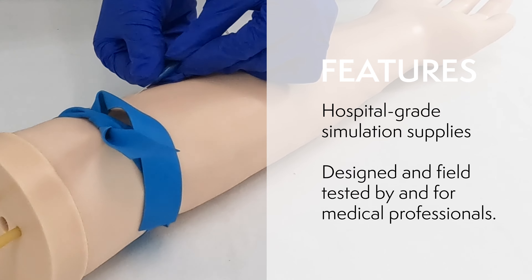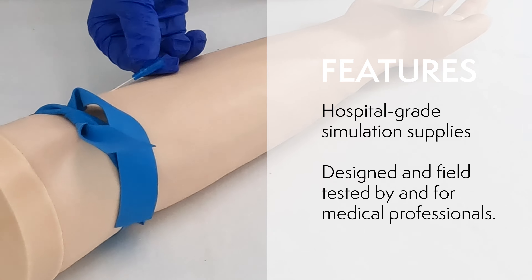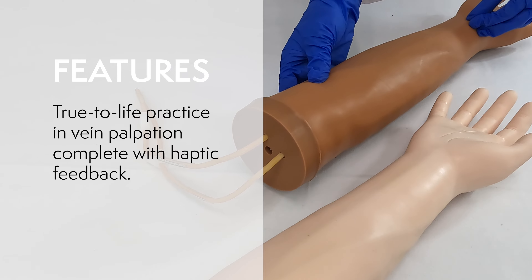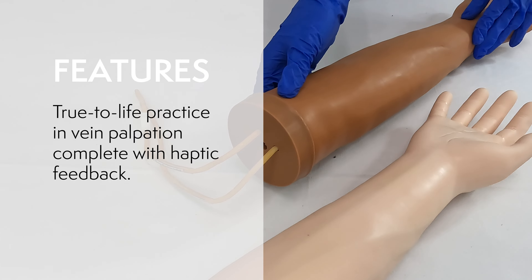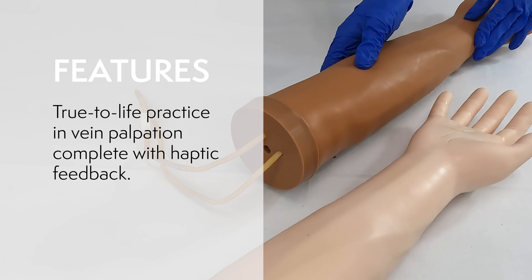The Anatomy Lab IV Practice Arm was designed in collaboration with and field tested by a 20-year veteran nursing instructor. Students will be able to practice visualizing and palpating areas for precise venipuncture and IV catheter insertion on this anatomically accurate simulator.